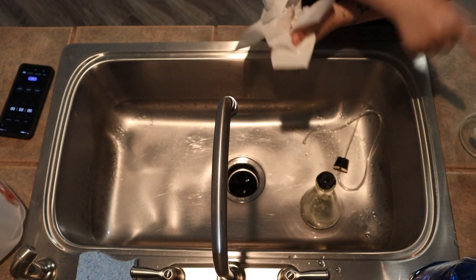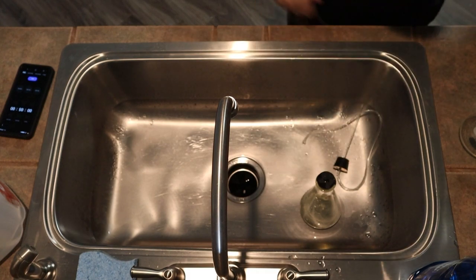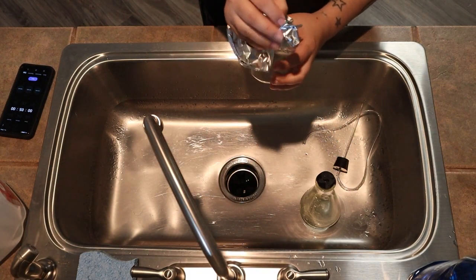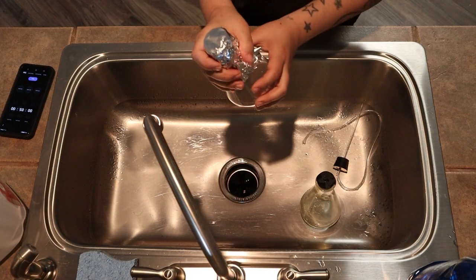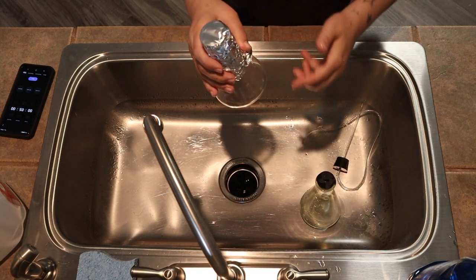Now what we want to do is cap this with some foil so no contaminants get into the jar. I'm going to clean the other one and come back, and then we'll fill these up with salt water.